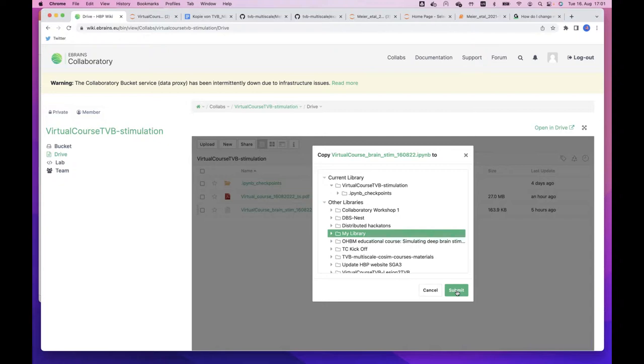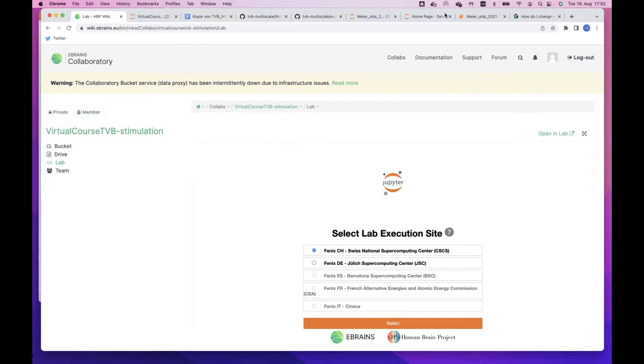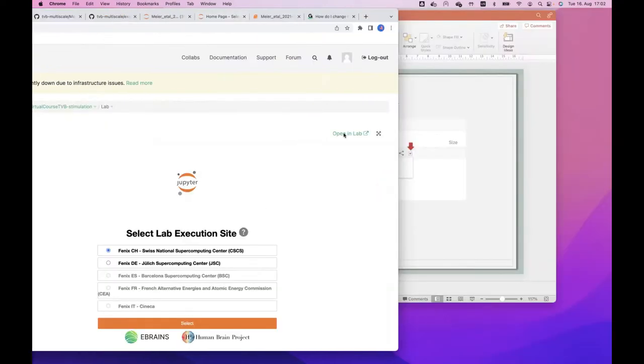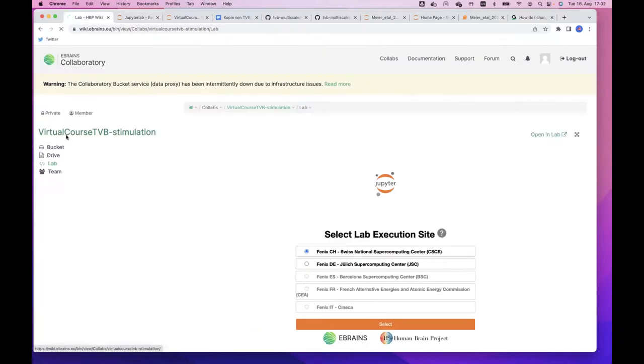Thank you for that. And then on the left, if you go to this collab on EBRAINS to the drive, you can see everything that I put in there, which are the slides to download, and then also the notebook that you can either download and run locally, or if you have an EBRAINS account and were added to the TVB group, you can just click here and say copy to my library, because if you don't copy it to your own library, then your changes will not be saved. And that's sometimes unfortunate. For now, it would not be too bad if you just open it directly. But when you want to make bigger changes, you want to play with it, it's good to put it into your own library. You have seen this process before, I guess, so it's fine.